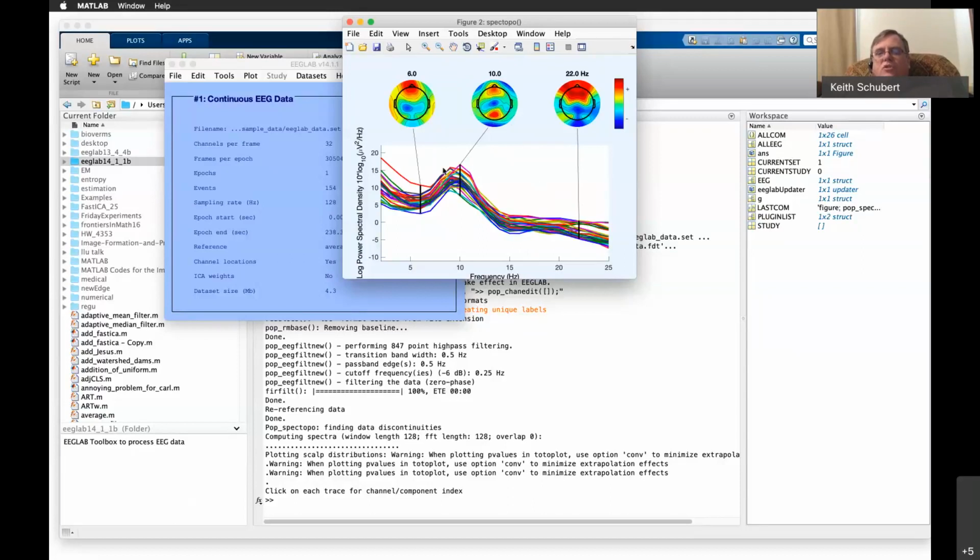So they're noticing the thing and causing the response. You can actually see the two main activities going on here. This one, heavily right in the front, is probably just purely muscle activity and action. Not too big of a deal.